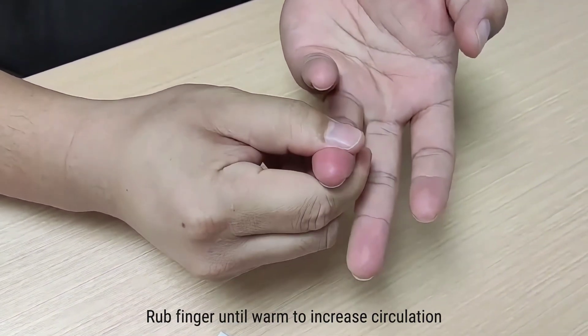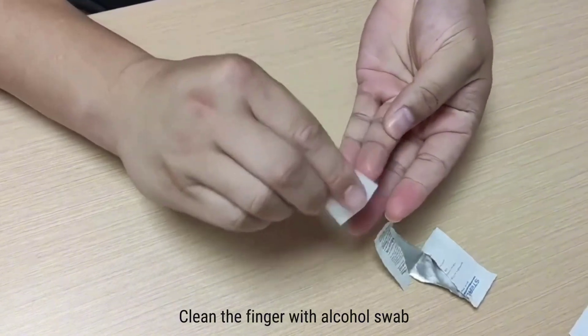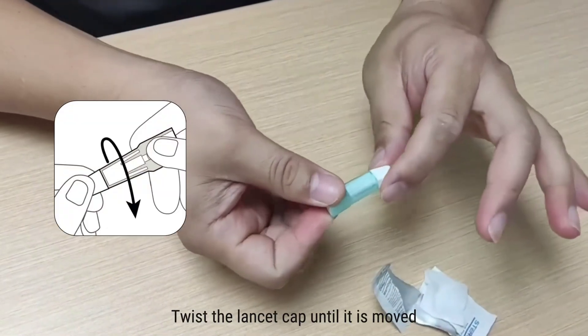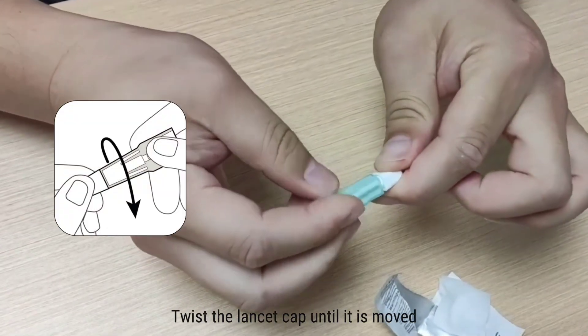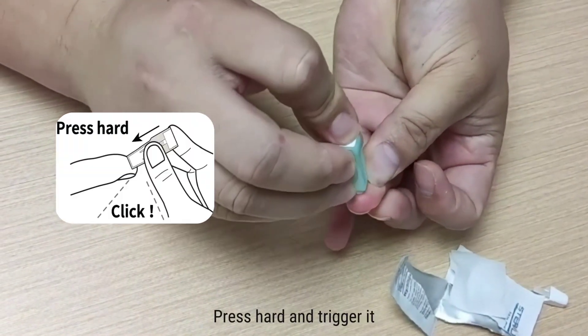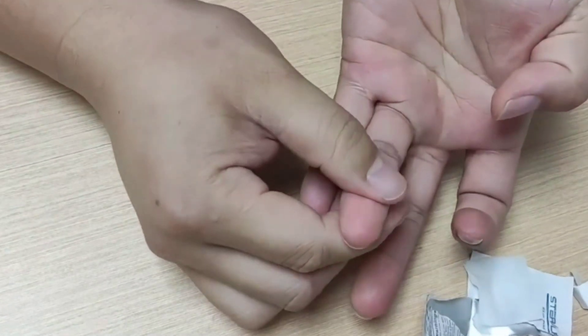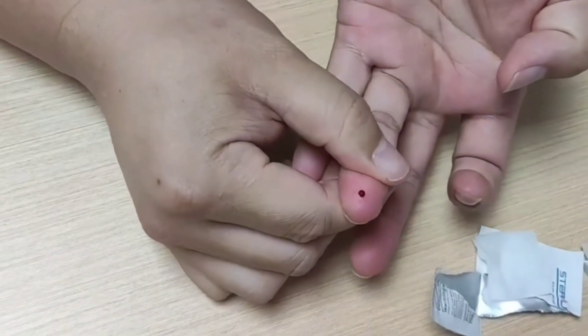Rub your finger until warm to increase circulation. Open the alcohol swab and clean the finger with it. Twist the lancet cap until it is removed. Place the lancet on the finger, press hard, and trigger it. The lancet will only prick once.